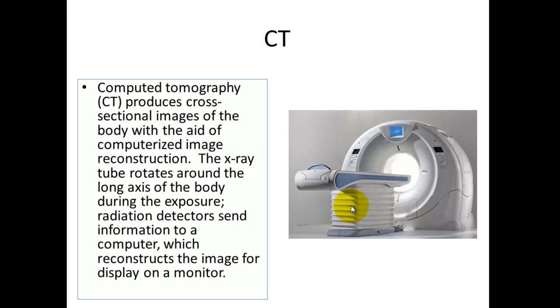In a CAT scan, if you think about a second hand going around and you freeze it, you have a tube on one side, and instead of an image receptor that you're used to, you would have a set of detectors. They will be making transmission measurements or attenuation measurements of the tissues that are traveled through approximately 1,000 times. About 3 projections per degree of rotation in a 360-degree circle.